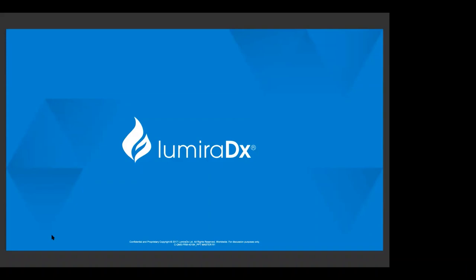Yeah, sorry, maybe that was unclear. When I presented earlier on and talked about the concept of the platform, we were talking about how some tests like INR, for example, coagulation, can run in as little as a minute to 90 seconds. But for the SARS-CoV-2 antigen test, it's a set time frame of 12 minutes. So each different test we design for the platform will have a different amount of time it takes. But certainly for the antigen test, once you put the sample onto the strip, it takes 12 minutes to run and produce a result at the end.